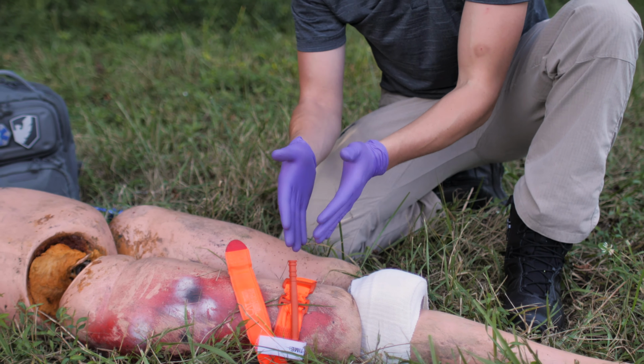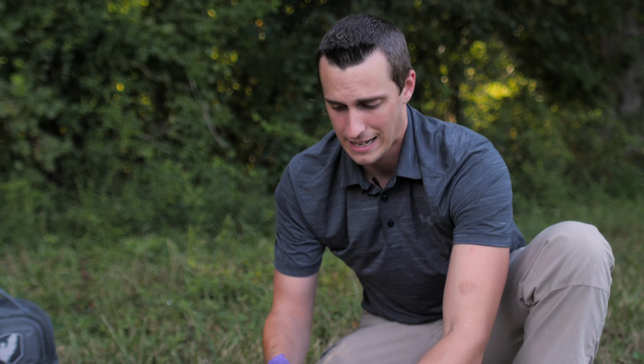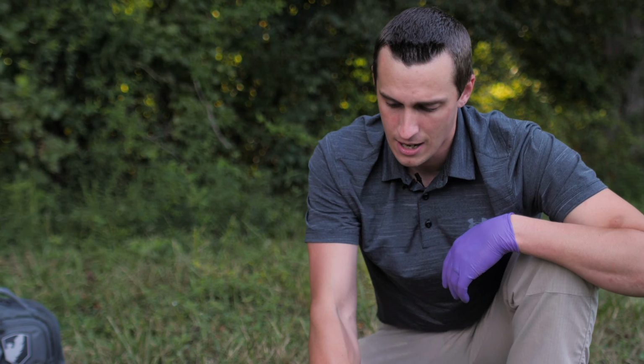So this is just a safety that we have in place so we're not scrambling to get a tourniquet on their leg. It's already in place, it's loose. We're not gonna tighten it until needed, but it's there just as a safety. So when we are in the C in the March algorithm, we are going to do things like apply pelvic binders. We're gonna reassess and tighten tourniquets, maybe some tourniquet conversions. We're also gonna do IVs, IOs, get fluid replacement, give blood products, all those things. But what we're talking about specifically today is reassessing, repositioning, and possibly even replacing tourniquets.